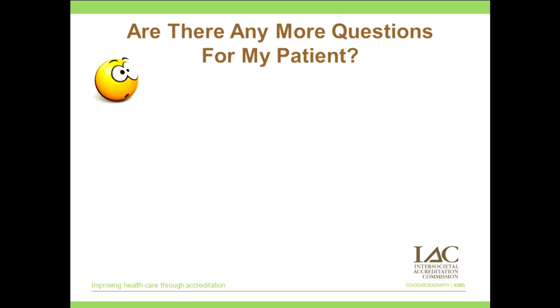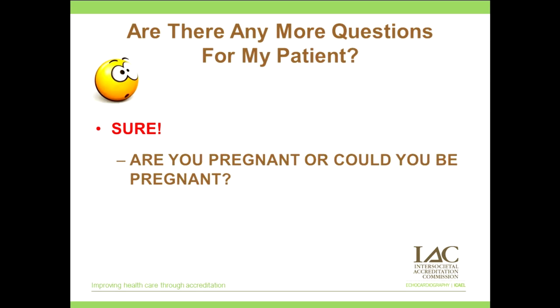Are there any more questions? Sure. Any woman in childbearing years, you'll want to ask them if they're pregnant or could be pregnant. You'll also want to ask them if they're nursing. And the reason you want to ask these questions is because contrast was not tested on these individuals. It was also not tested on children. And because it was not tested, it is listed as a warning in the package insert and is not under contraindications.